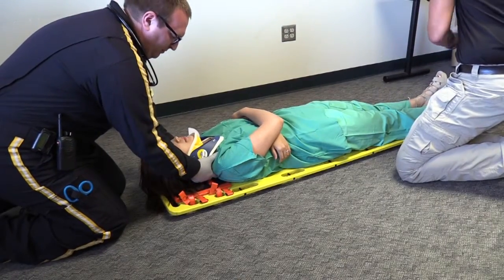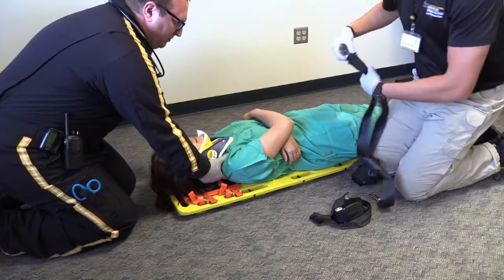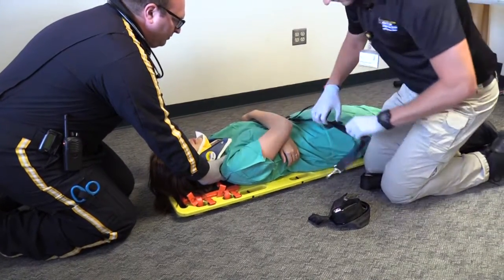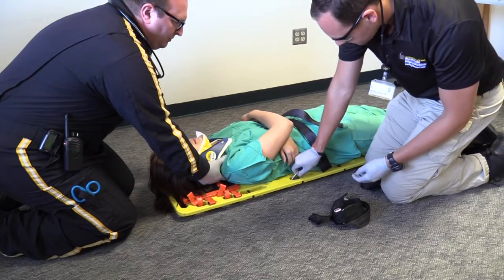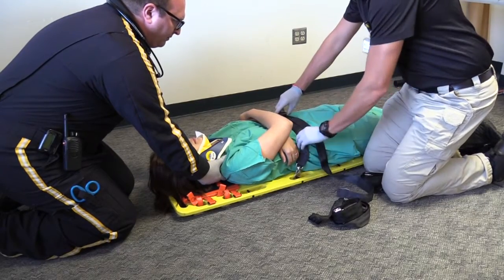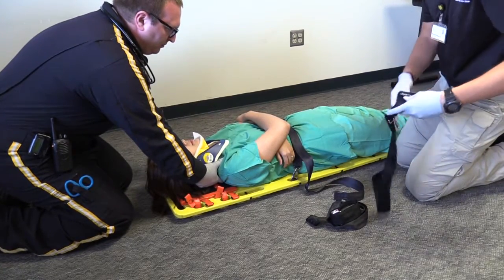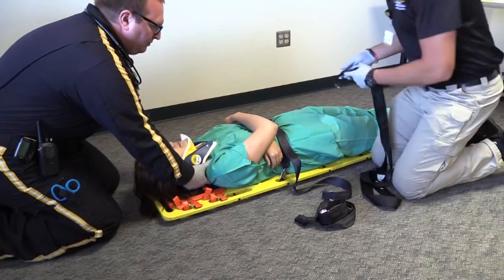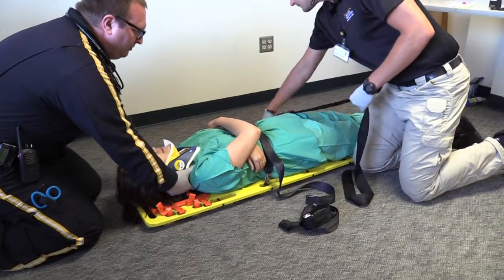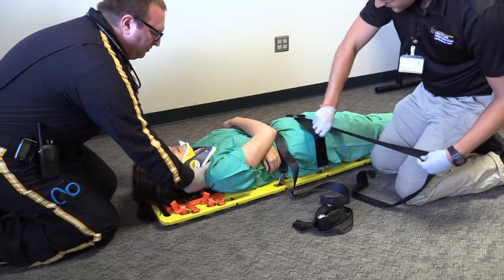I will then pad any void spaces and begin securing the long backboard straps around the patient. I will start by securing the patient's torso and hips to the long spine board, followed by the patient's legs.